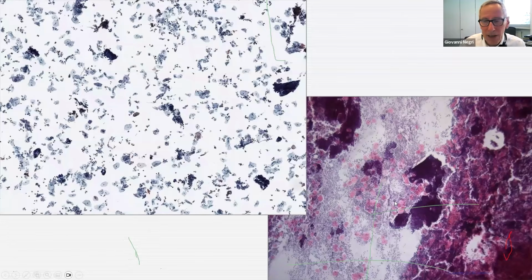That's evident also at low magnification, in conventional smears, and it's easier in liquid-based cytology. You see a number of very dark sheets of cells, hyperchromatic crowded groups, and actually in adenocarcinoma in situ, in most cases you have quite a high abnormal cellularity.